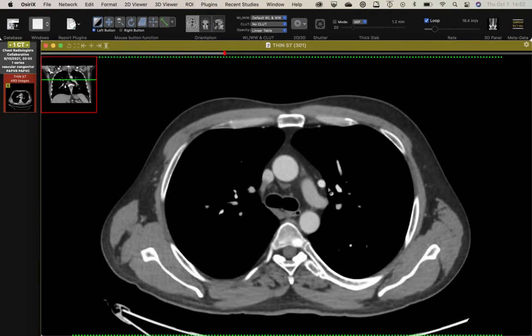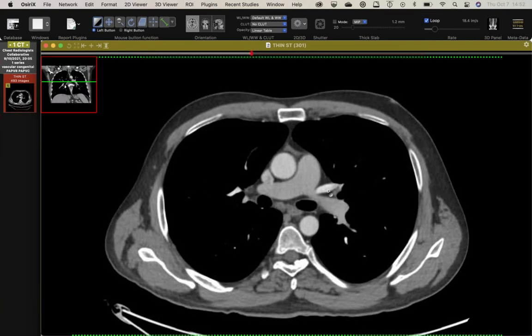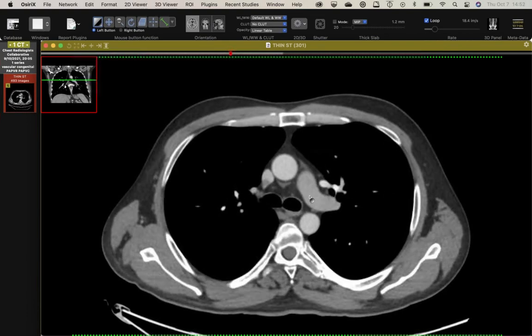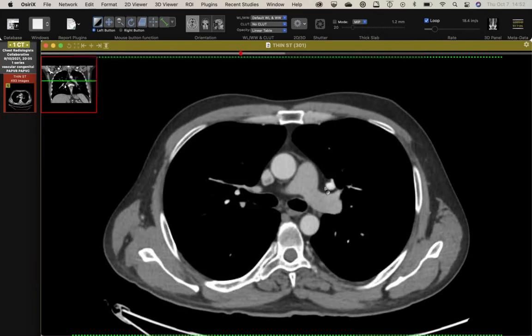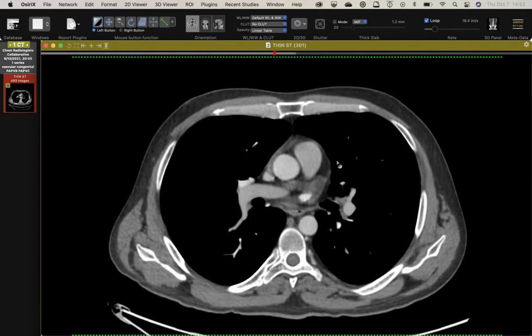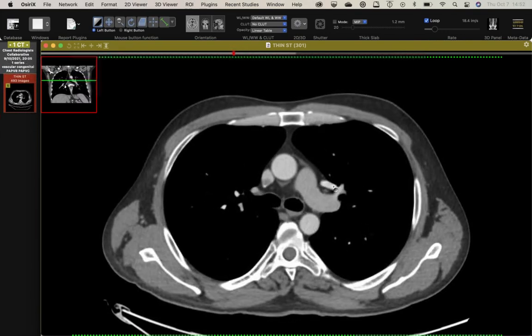And in this case, it's kind of cool. So clearly we can see it connect to this vein coming into the lung. So this is anomalous venous drainage, but what caught my attention is it keeps going down and it connects into the superior pulmonary vein. So effectively you've got the left atrium communicating with the left brachiocephalic vein. Now the atrium should be higher pressure, so I would suspect blood is going north, and it would depend on the dynamics of this lung, and who knows, it may change with exercise or exertion. I've seen a left SVC, but I don't recall seeing one still communicate with the left superior vein directly. Have any of you ever seen that?